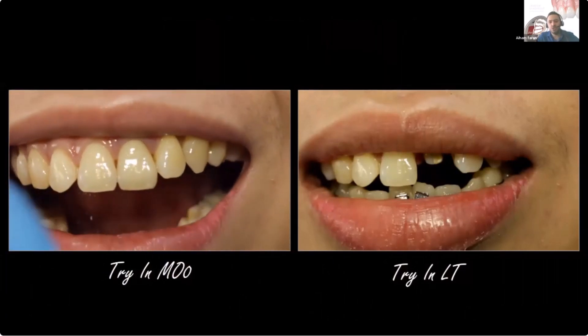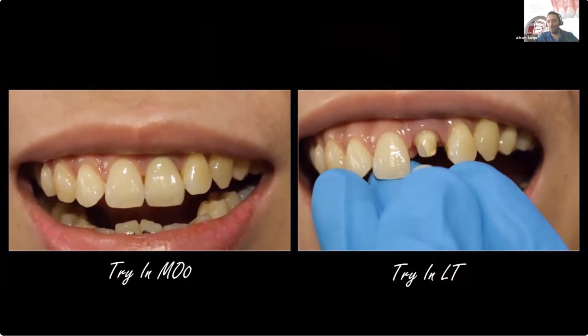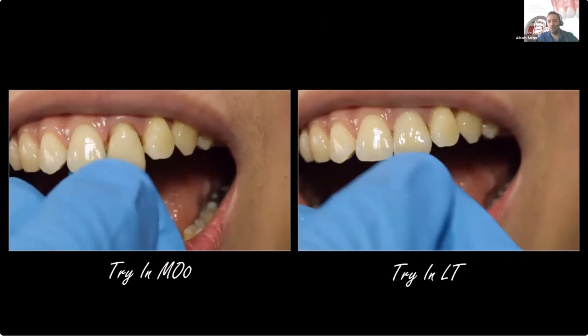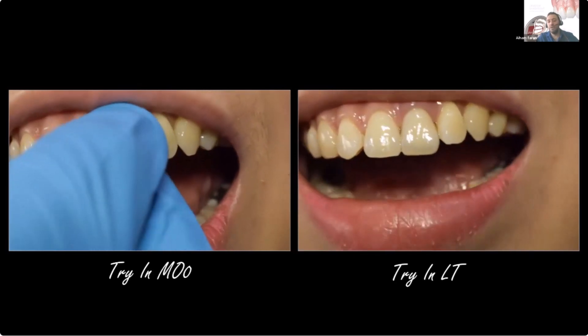Back to our central — the one we tested by pressing all the ingots to figure out which is the best ingot for this case. What I selected here is: I did two sets, one MO and one LT.